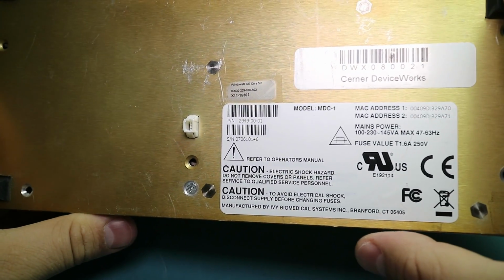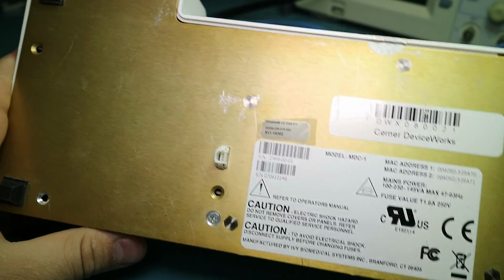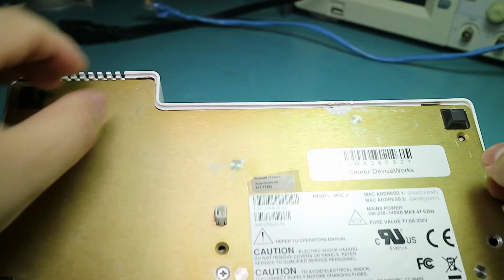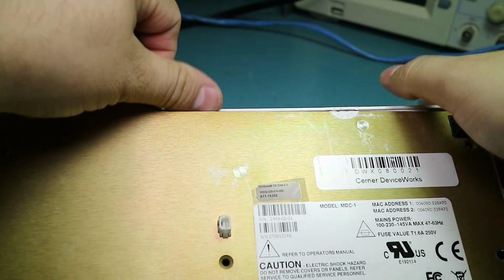And there's also not too many approvals on this. So I'm thinking, like I said, it's not really meant to go anywhere near people. It's really just for the reception area and that kind of stuff. So you can kind of pop out the whole chassis.